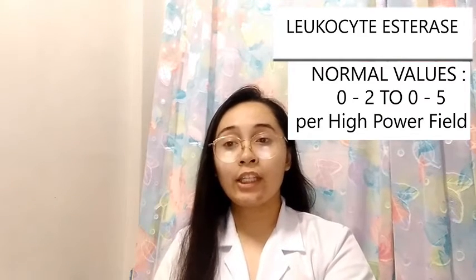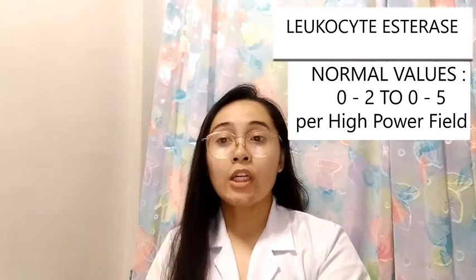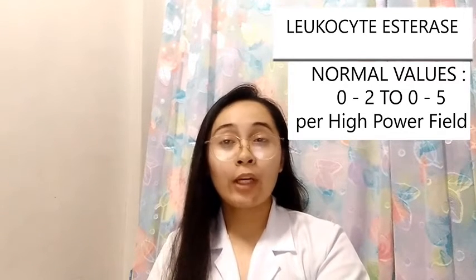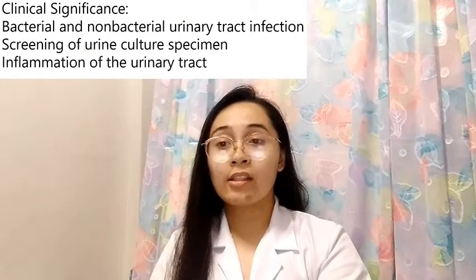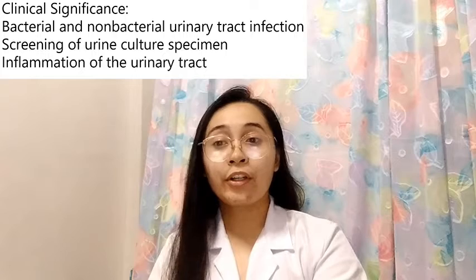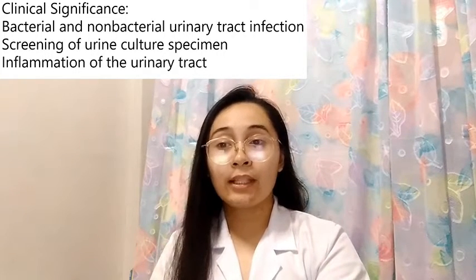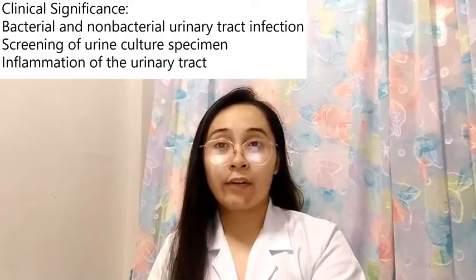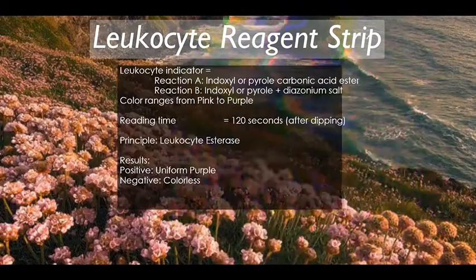Leukocyte esterase. The normal value for leukocytes in urine is 0 to 2 or 0 to 5 per high power objective field. The clinical significance includes bacterial and non-bacterial urinary tract infection, screening of urine culture specimens, and inflammation of the urinary tract.